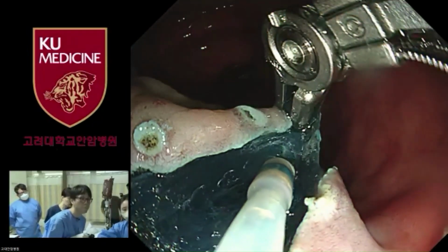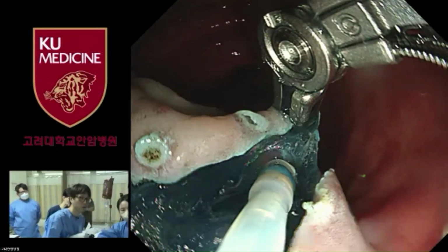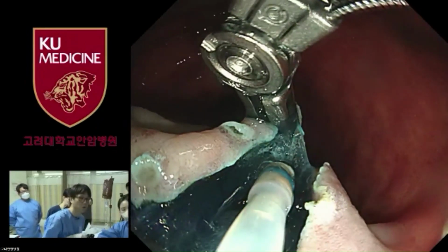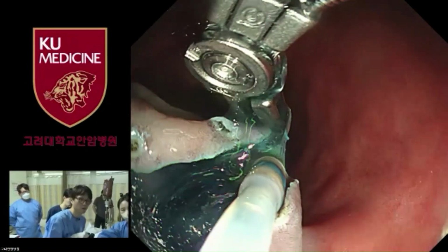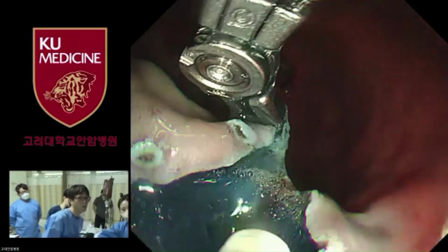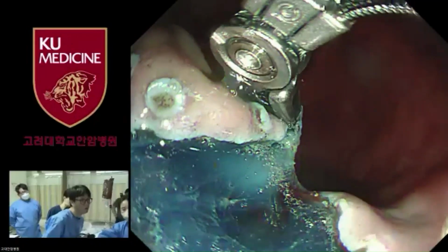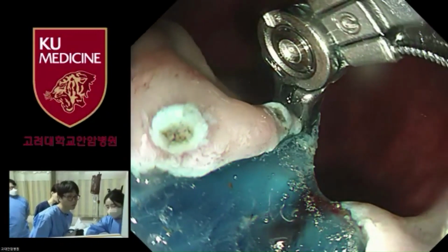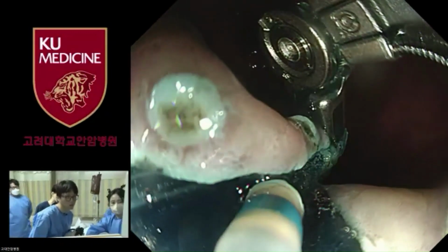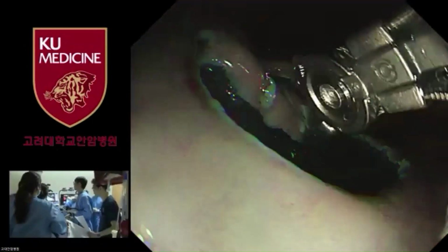If the operator is familiar with the movement and control of this device, the operator can do it by him or herself. But if the operator is not that familiar with the control of the movements, other assistants such as other doctors or nurses can assist and control the arms and the roll motion.